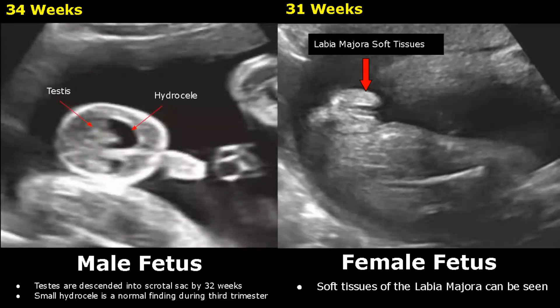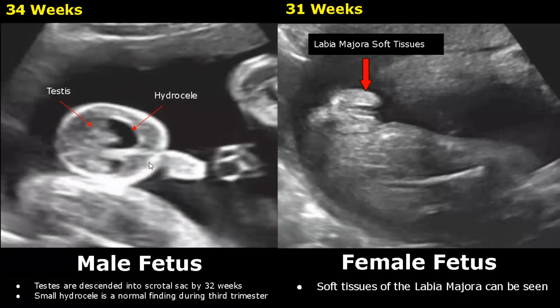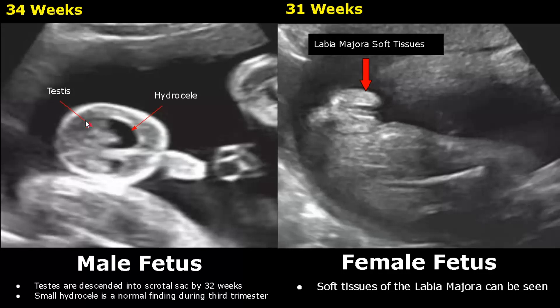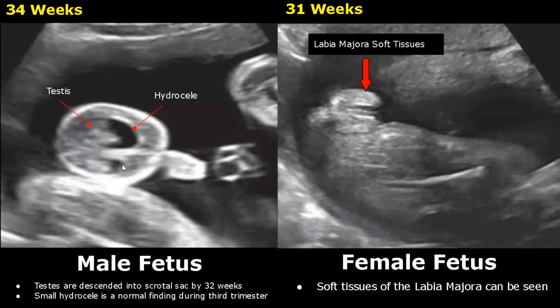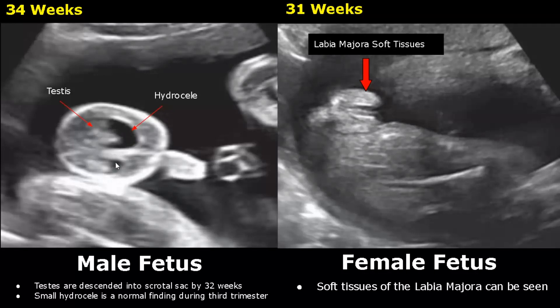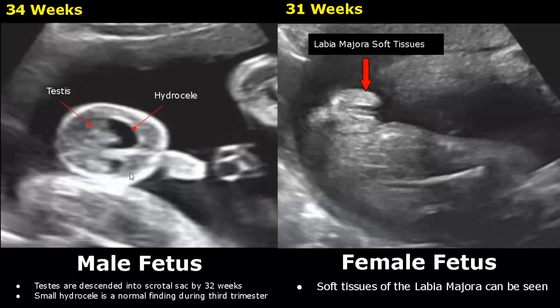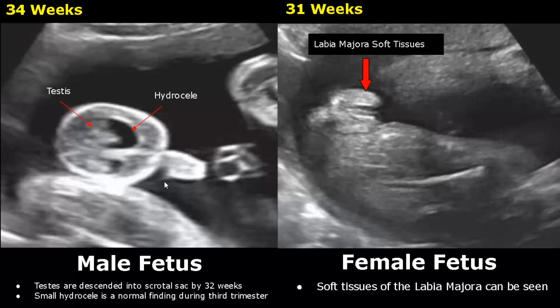This is an image of a 34 weeks old male fetus and we can see the testes within the scrotal sac. There is also some fluid outside the testes — the hydrocele. In the third trimester, such hydroceles are a normal finding.